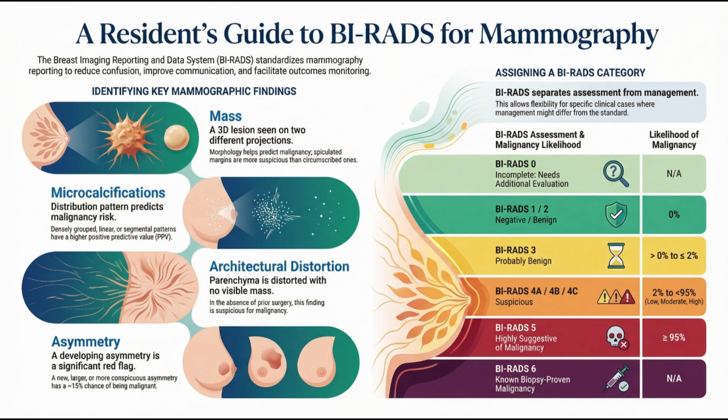Second, you need a succinct description of the overall breast composition. This is absolutely vital. And that's about breast density, which I know is a big topic. Why is that specific description so critical? Because breast density affects 2 things, both the risk of cancer and just how hard it is to even read the images. BI-RADS has 4 categories for it, from A, which is almost entirely fat, to D, which is extremely dense. And if you have dense tissue, C or D, it kind of acts like a smokescreen. You can hide potential tumors.